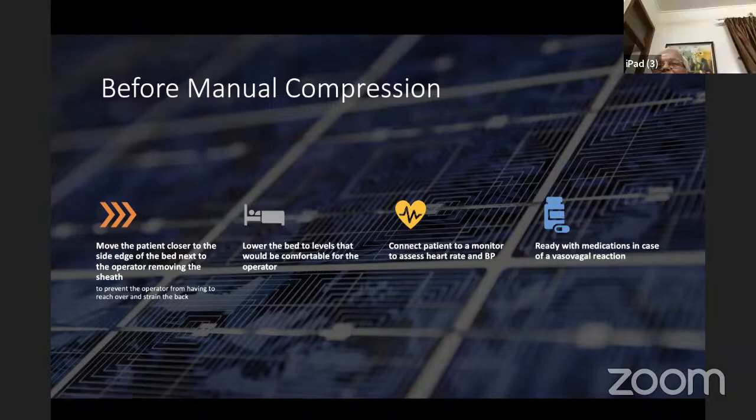If you can make a roadmap, that is ideal, but it's not always possible to make a roadmap. We showed that the left femoral artery was punctured under roadmap because we had injected contrast on the right side. Nowadays you get very small probes also. If you can get a small probe and do the ultrasound, that is much better.